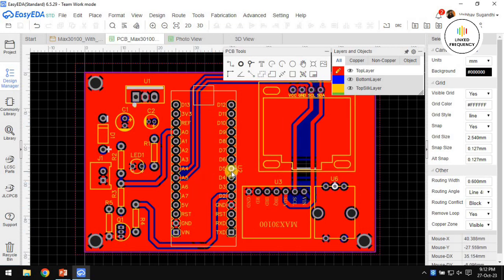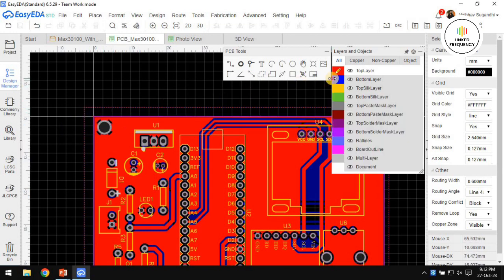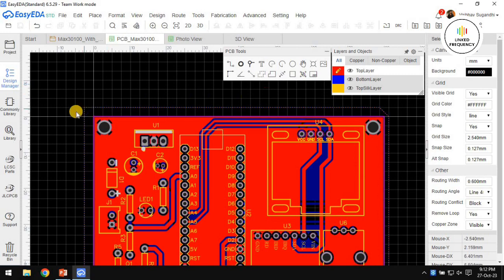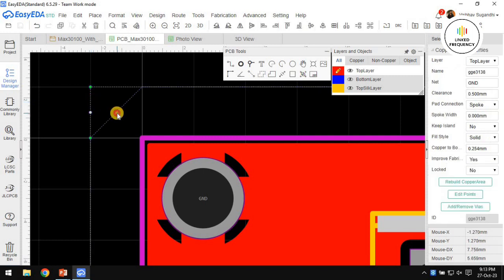There is no SMD component, all are through hole components, all are modules, but still we are using two layers of copper while designing the track from one point to another. Along with that, when I poured the copper for the ground connection, I poured it for the bottom copper as well as the top copper. I created this small notch here so that whenever I want to select a specific copper layer, I just need to select it one by one. If I overlap one on the other, it is very difficult to select a specific one. While you are in the top layer, you can also select the bottom one. So that's why it is mandatory to make a small notch on the edge of the copper pouring.